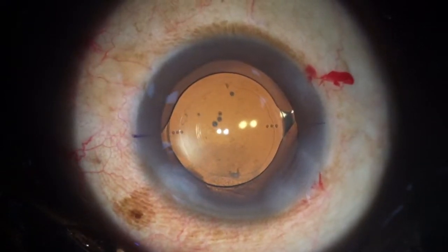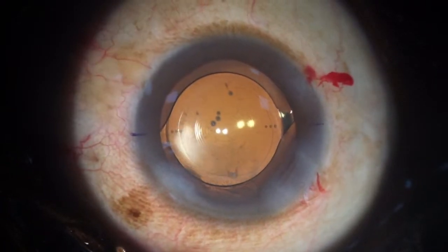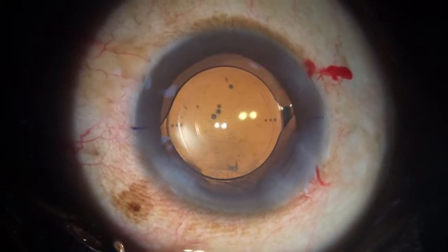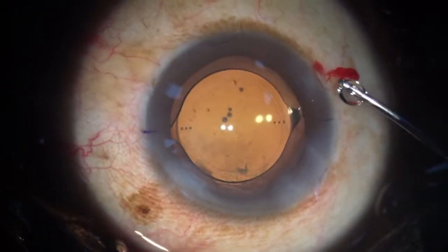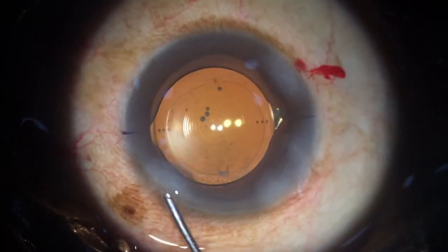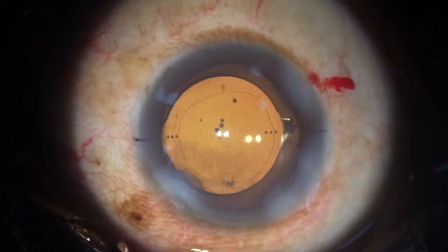And they work beautifully well for distance, near and intermediate. But if some patient desires slightly better near vision, a mix and match is very easily possible. And since they are identical lenses in every other way, they do very well as a combination. And you could actually use geometric plus in both eyes also, if you want to give better ability for near than distance, if some patient is demanding it like that.